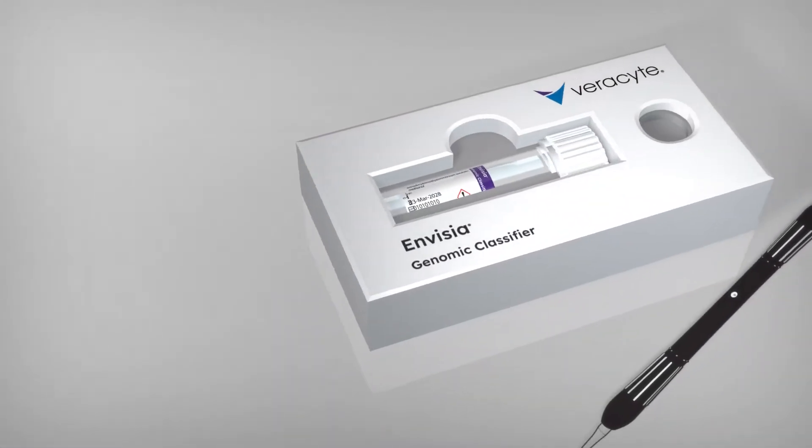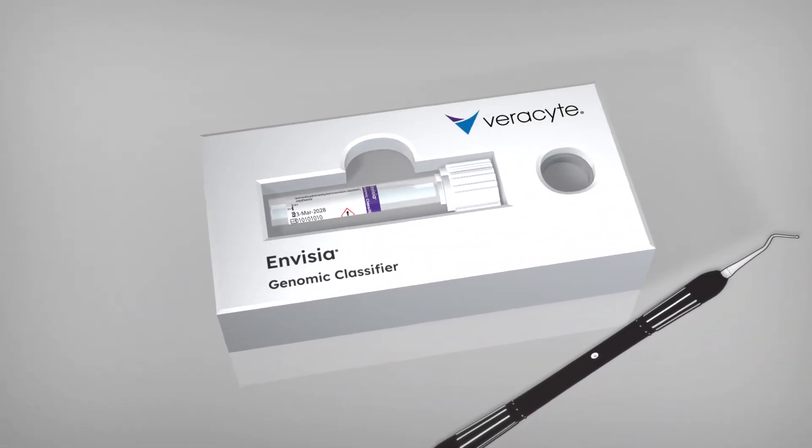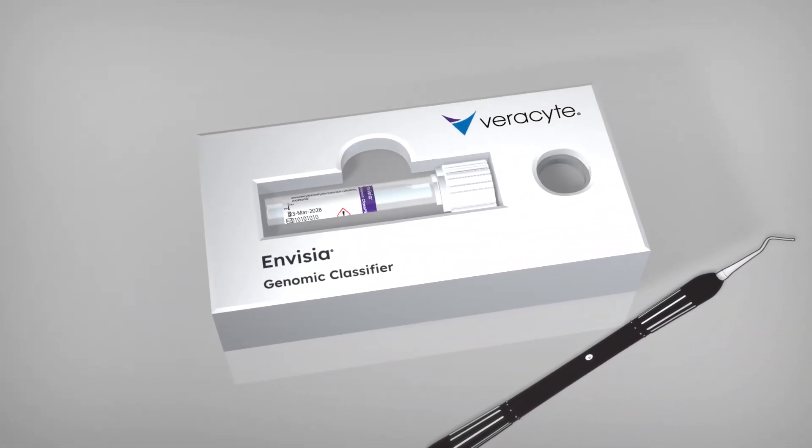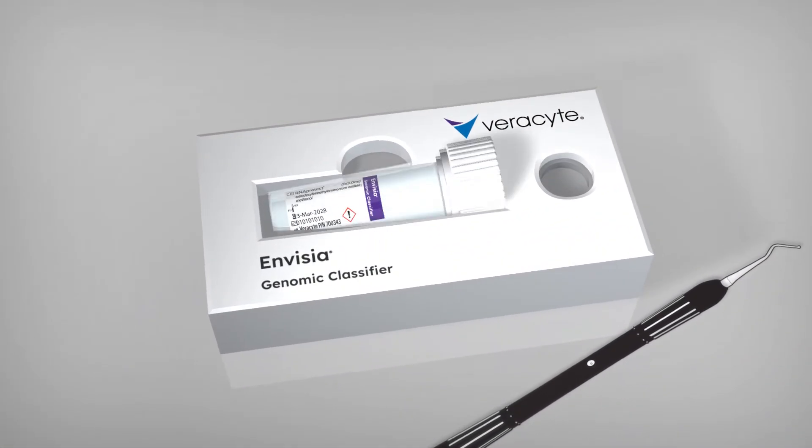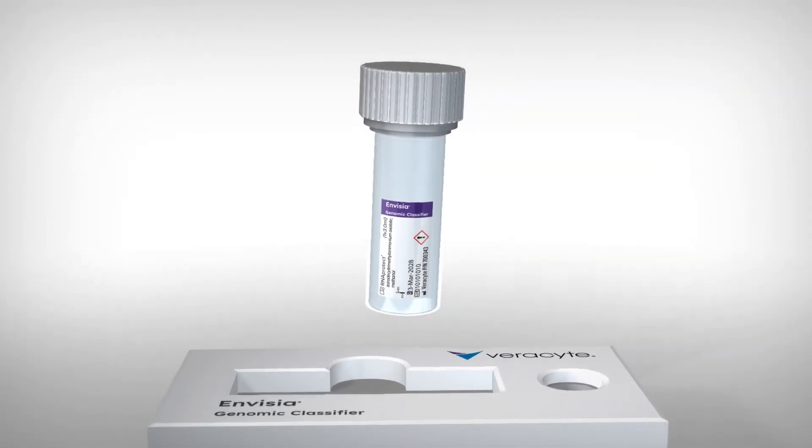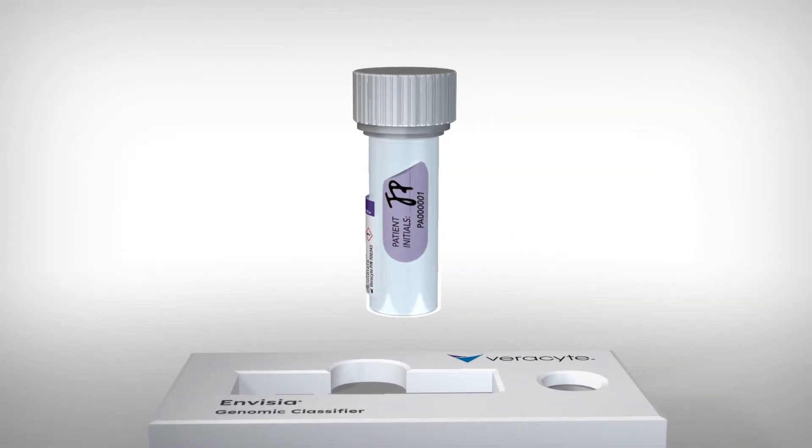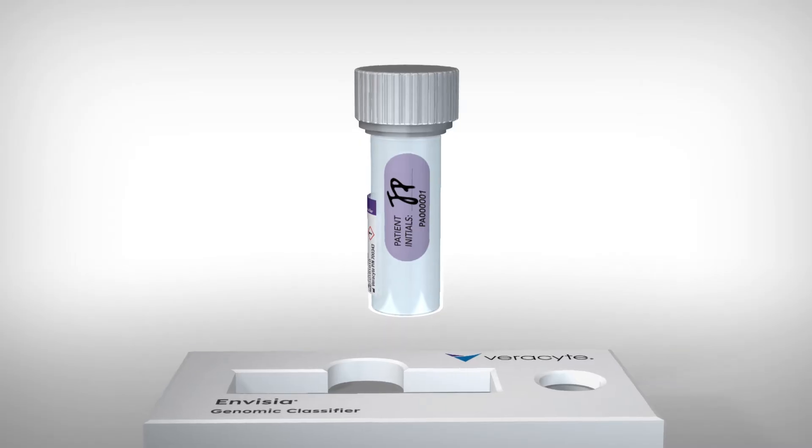Open the bag, removing the transfer device and stand containing the pre-filled specimen collection tube from the box. Apply the label with the patient initials on the collection tube.